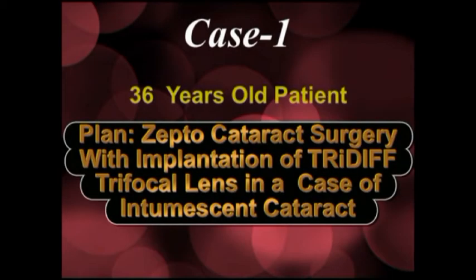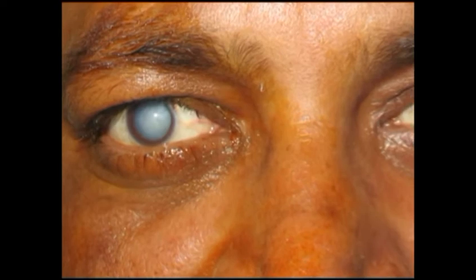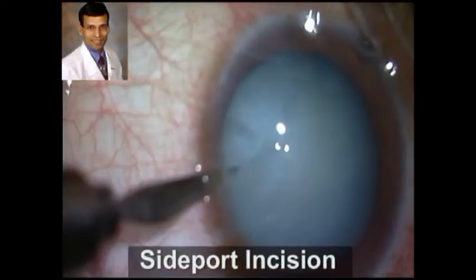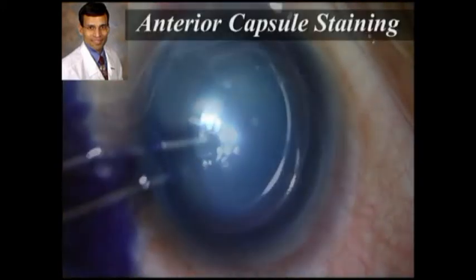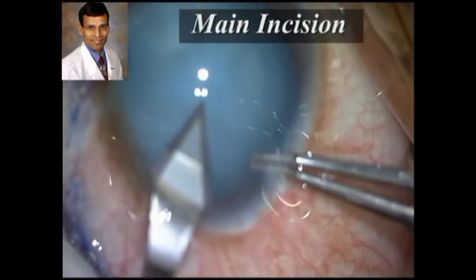This is the first case, a 36-year-old patient who had an intumescent cataract, and we planned to implant a Tri-Diff trifocal lens. This white cataract can be seen even from a distance. He desired spectacle independence, therefore we wanted to implant a Tri-Diff IOL. This is the routine sideport incision being made, with the air bubble visible, and then we stained the capsule for better visualization during the phaco procedure.